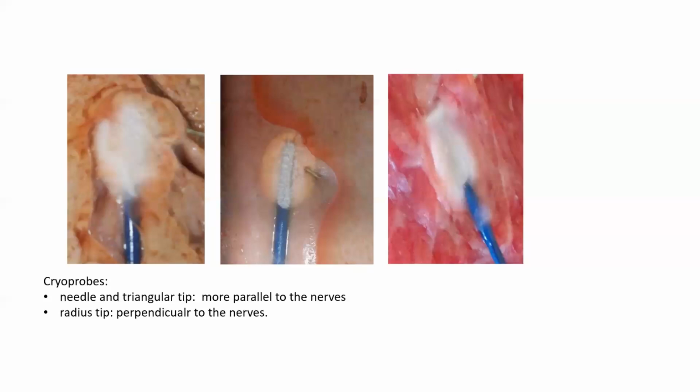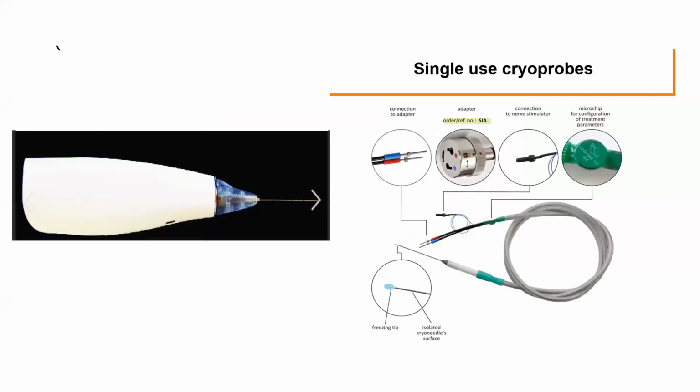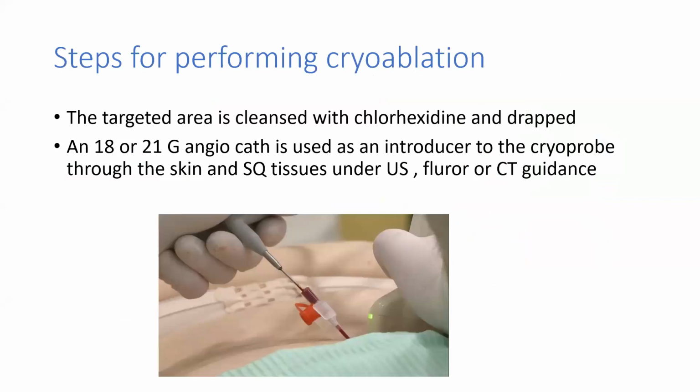Same concept as the cryoablation, the cooled radiofrequency ablation. This is a different system. Again, the one on the left is more portable, and you can use it for superficial structures. There are other different systems that we have used. I remember when I was a fellow at Cleveland Clinic about 12 years ago, we had a machine that was about 30 years old and it was still functioning. So there are different systems here in the market depending on what you prefer and what your uses are.